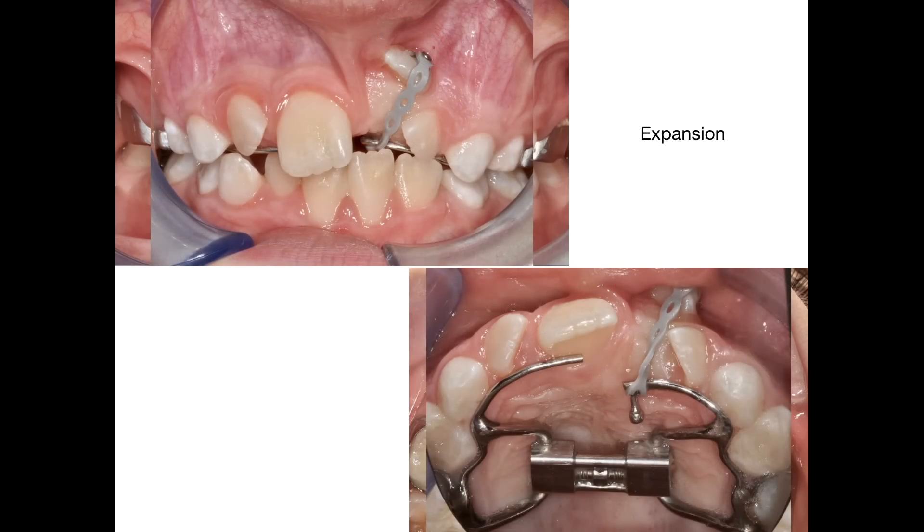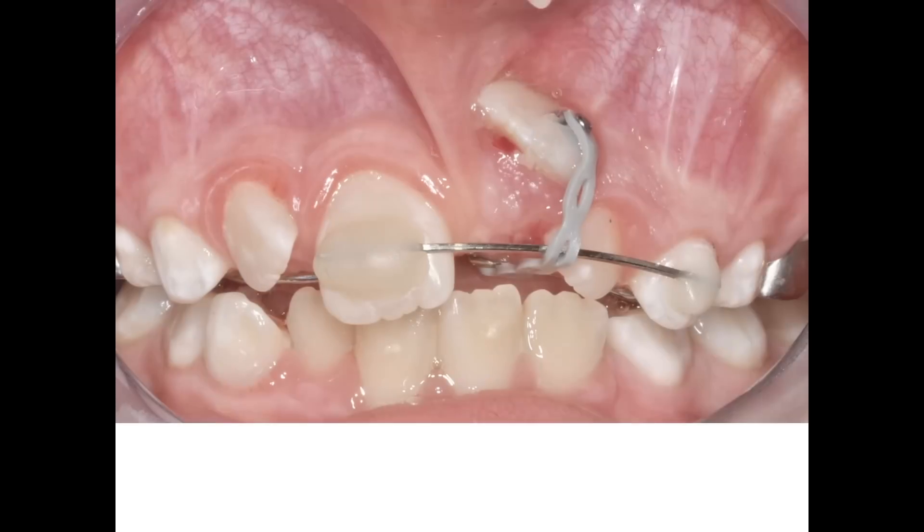The traction, performed with an elastic power chain, will diminish the central incisor's torque while also extruding it. But unfortunately, the power chain is damaging the gum. So I decide to bond the 19 by 25 TMA sectional wire to the adjacent teeth and make the power chain pass over it in a way that it won't touch the gum.